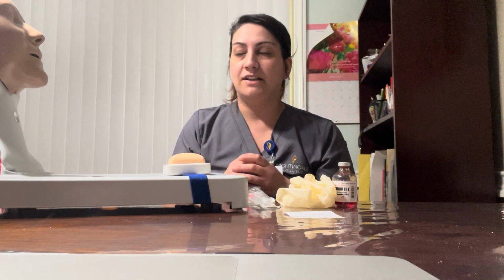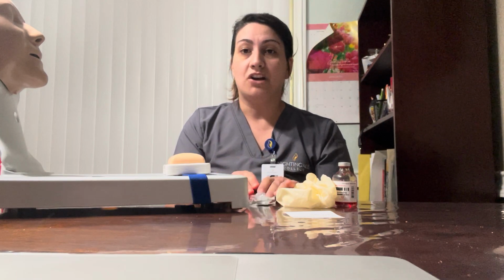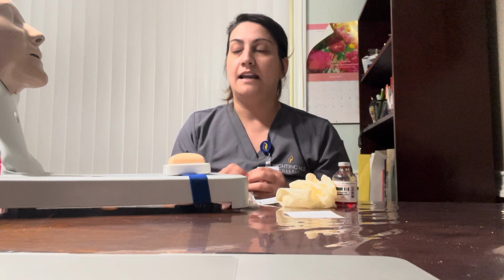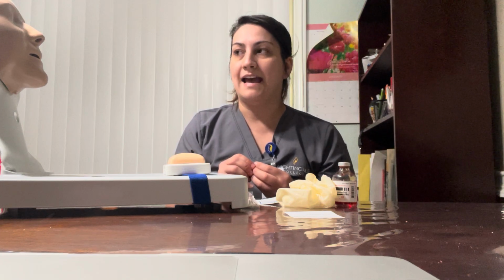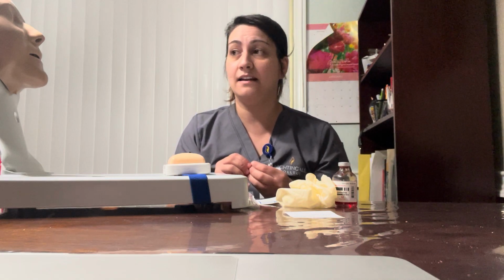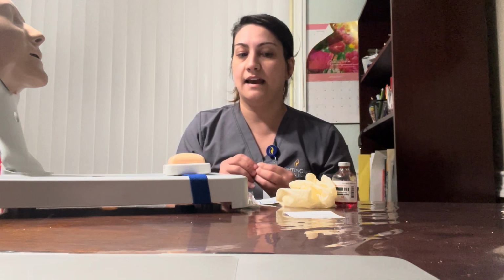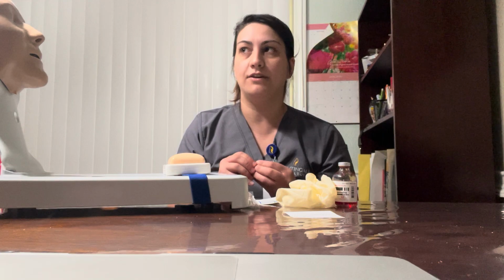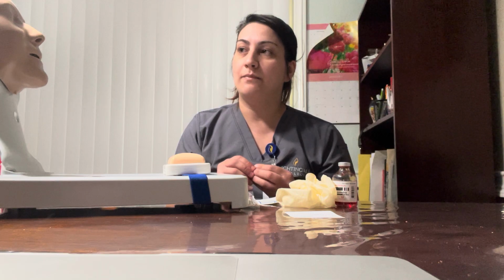All right, Ms. Smith, do you have any allergies? Do you have any seasonal allergies, any medication allergies, or any food allergies? No? Okay, perfect. So today your doctor has prescribed you an injection. This is a PPD. This is used to test to see if your body is immune to tuberculosis or if you're infected with it. We will inject a little bubble underneath your skin, and we will have you come back within 72 hours to check and test.